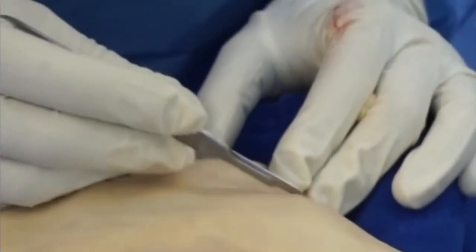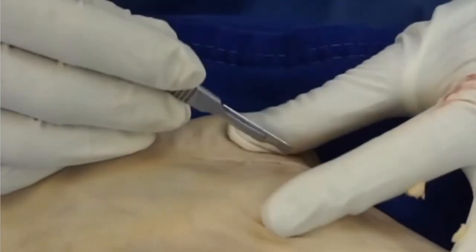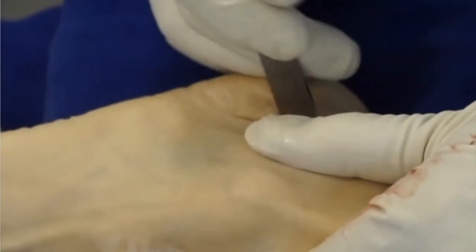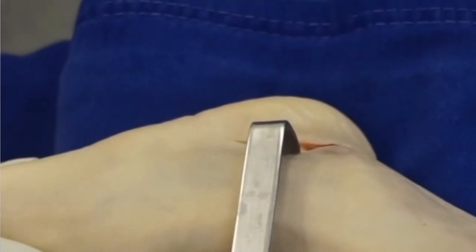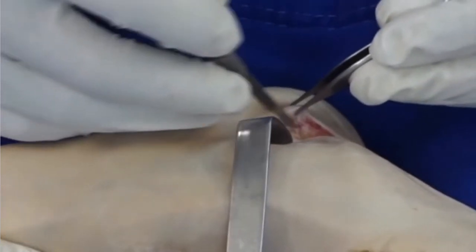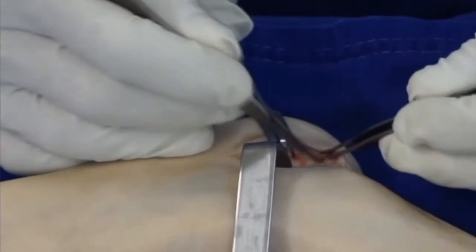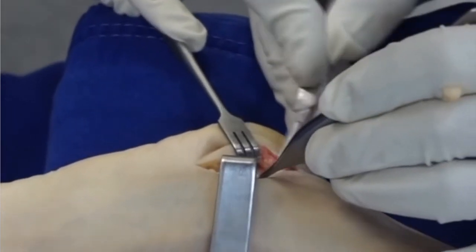Once we're done with that, we start with the calcaneus. My incision starts one centimeter below the tip of the fibula and extends at a 45-degree angle obliquely. Be careful of the sural nerve and make sure that your subcutaneous dissection protects the nerve. Here you can see I'm using the back of the knife blade to push the soft tissue away, then retract it, and then cut straight down onto the bone without risking damage to the sural nerve. Through this incision, I'm going to do not only the osteotomy but also the peroneus longus to brevis tendon transfer, so your incision needs to be long enough to accomplish both.